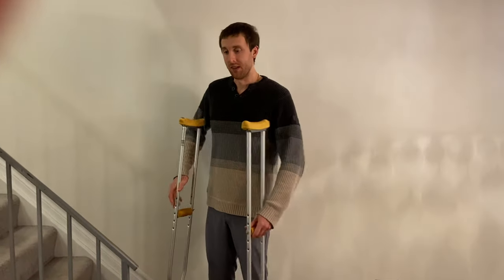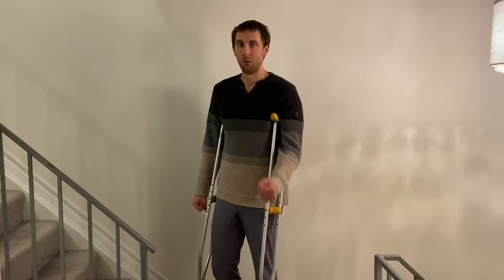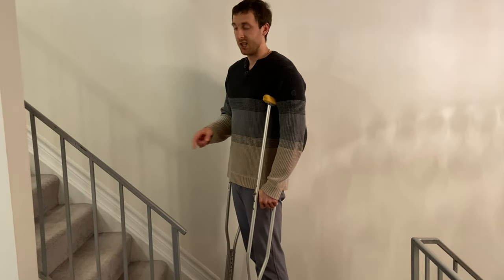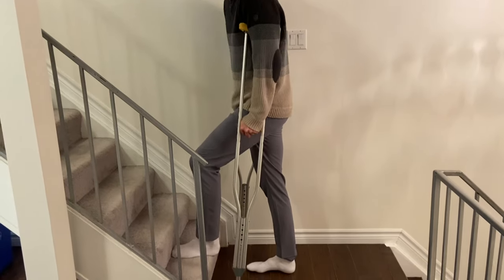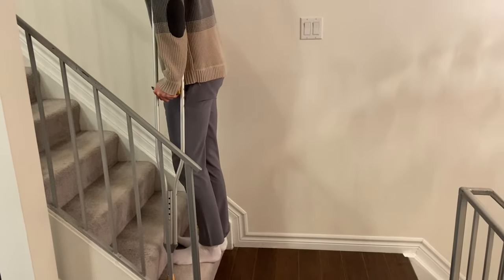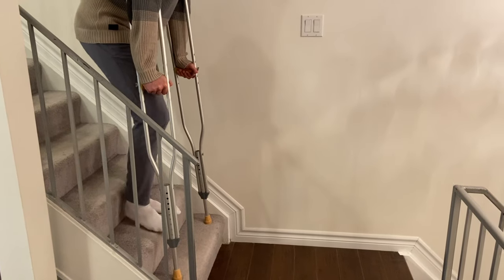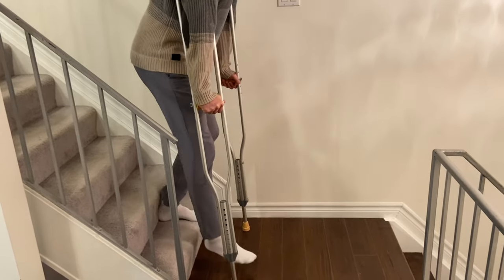If you can put weight on the leg, it's a little bit easier. We teach: good leg leads going up to heaven, sore leg leads going down to hell. Going up, bring your strong leg up first, push down into the crutch, then bring the sore or injured leg to meet up with it, and crutches come up last. Going down, the crutches go down first, then the sore leg — pushing down into the crutches to take weight off — then the good leg. So the pattern is: crutches, sore leg, good leg.